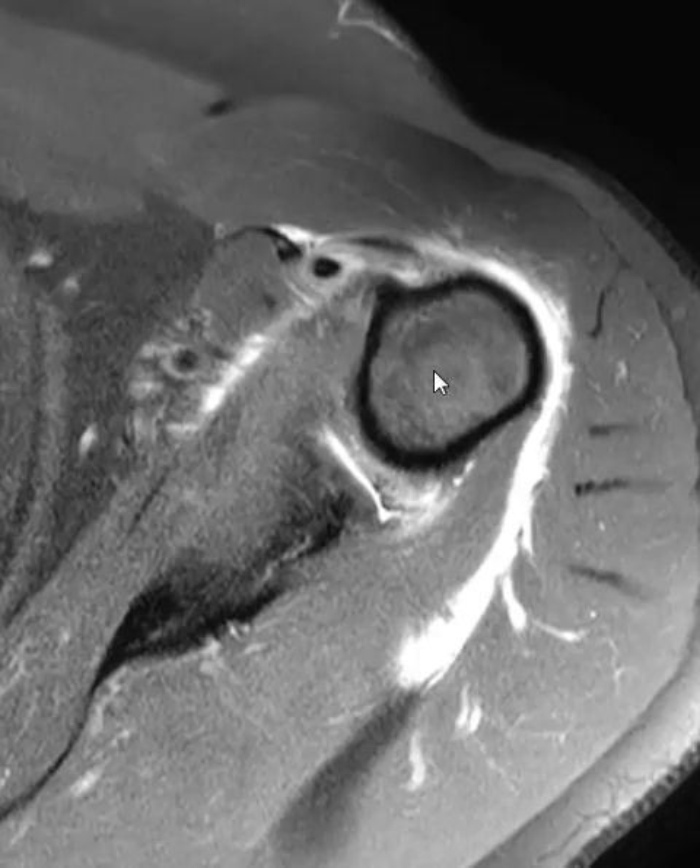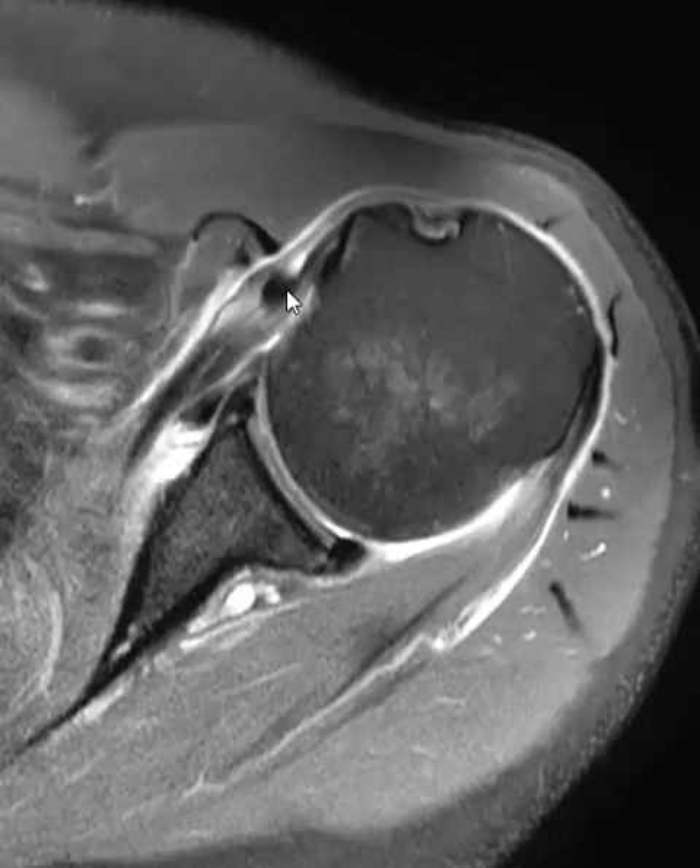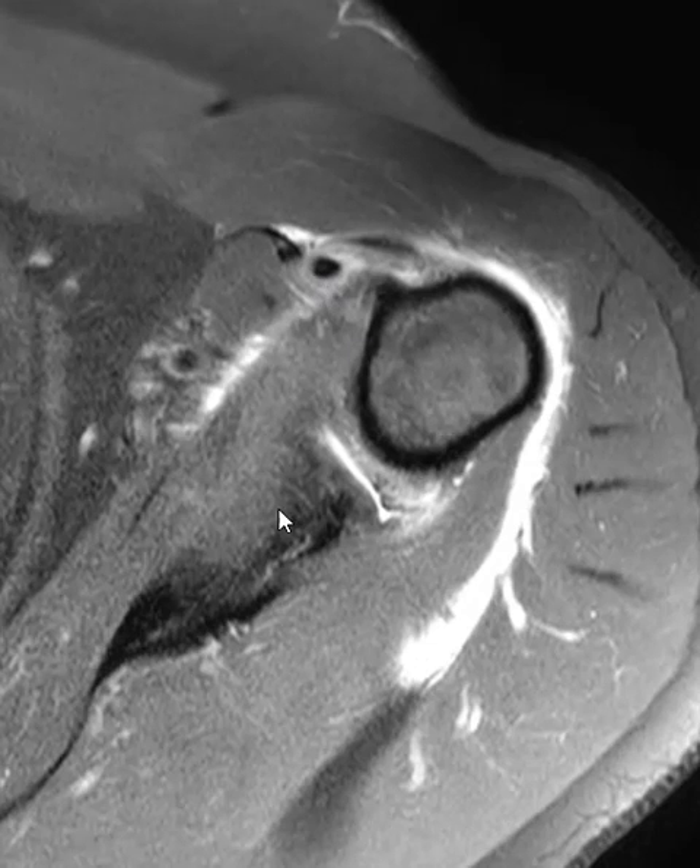So this is a biceps tendon dislocation. Here it is again, medial to the bicipital groove. Thank you very much.